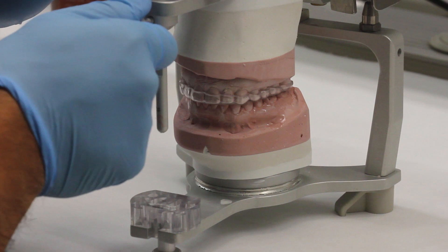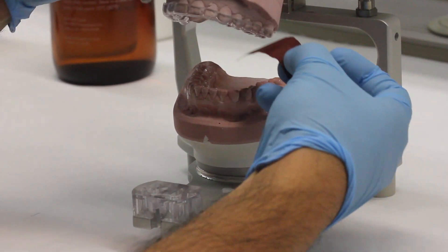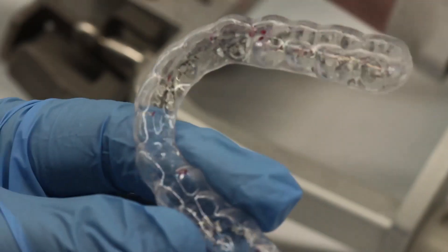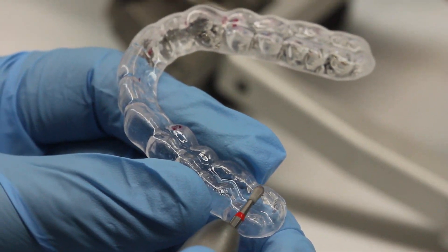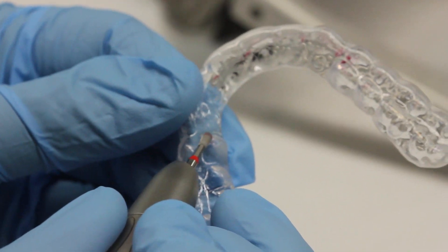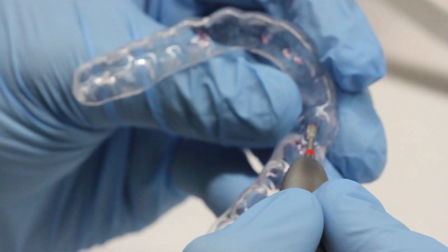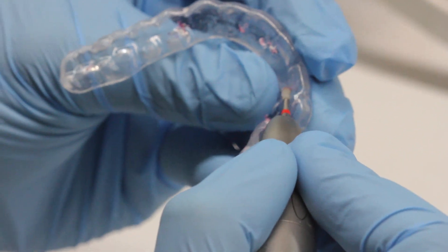The next step is to check the occlusion. We want to adjust the splint so that you have a minimal amount of space — maybe two or three millimeters — between your splint and the mandibular cast. Once you have the marks, take an acrylic burr on your straight handpiece and start to adjust out the areas that come into contact. Go around and check where your marks are and gently remove a little bit in each area that has a mark. Remember, in the posterior you don't need to grind as much because it's on a hinge.